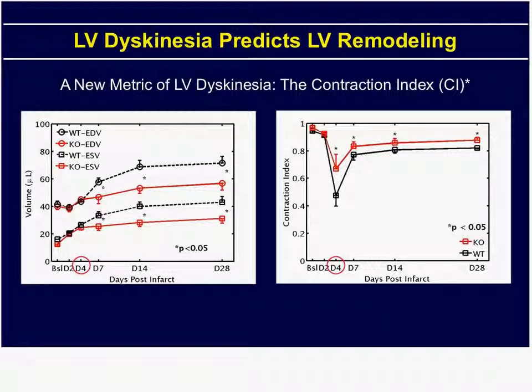minimizing impact on the area where you're going to apply the transducer. There are also post-processing approaches that Dr. Hossack is developing, and these involve principal component analysis to essentially denoise the images and try and re-extract the data that is being obscured by those artifacts. And so he has an IEEE paper.